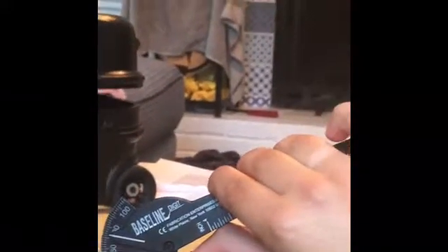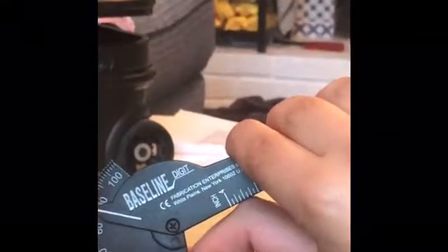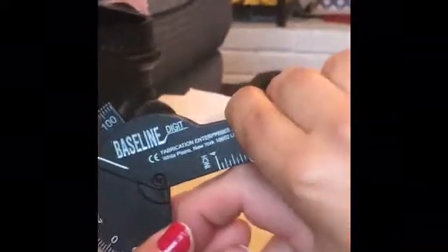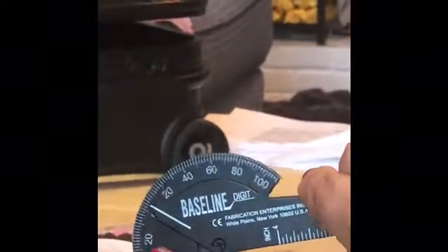Go. We're going to be measuring the finger DIP joint flexion. Range of motion is 0 to 70 typically. The axis is the dorsal surface of the DIP joint of the finger tested. Stable arm is dorsal and midline of the middle phalanx of the finger tested, and moving arm is dorsal and midline of distal phalanx of the finger tested. So we're starting out at 70 degrees, and our goal is to bring it up to 0. And there it is, at 0 degrees.